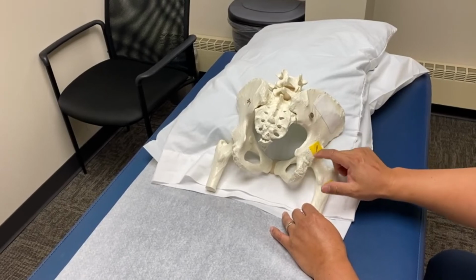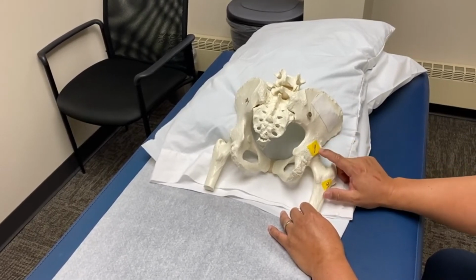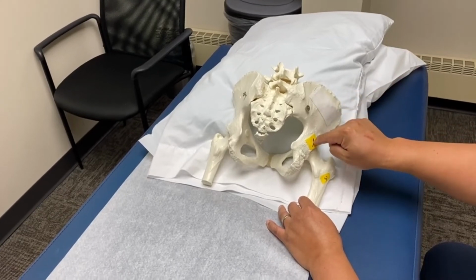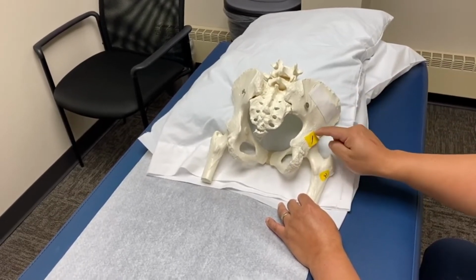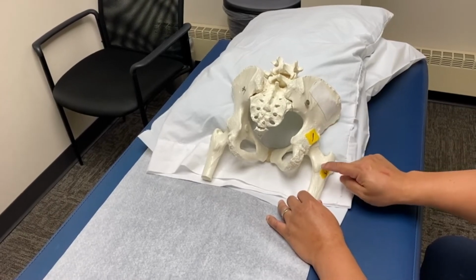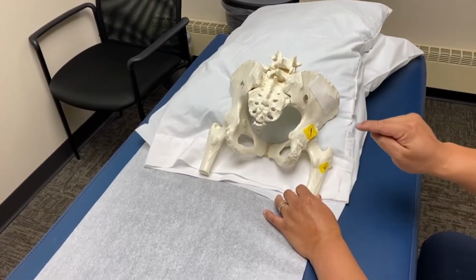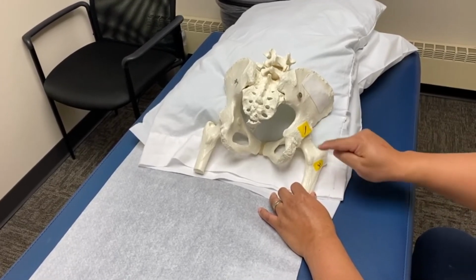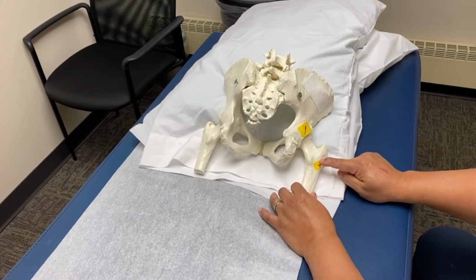We put a needle into this area indicated by a 1, which goes through the glute max down to the piriformis onto the posterior aspect of the acetabulum. I'm going to put a second needle indicated by a 2 that goes through the glute max down to the quadratus femoris on this side, on the distal side of the hip joint.